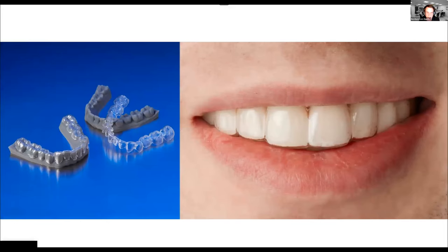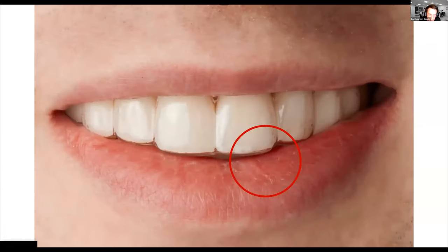And if we take a look at the clinical result of an aligner produced on such a model, this one was printed with 160 microns, it is actually very satisfactory. It shows no very visible layer lines, because what you see if you're looking at this aligner in the patient's mouth is mostly the vertical faces. And they have only very little convexity. If you look closer, you will see that you can detect some layer lines in the incisal edges. But again, in the mouth, the saliva is also helping a lot in disguising this effect.